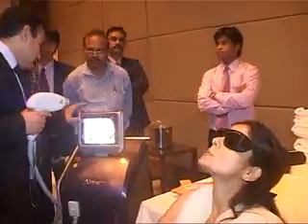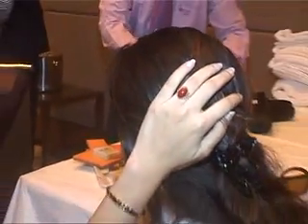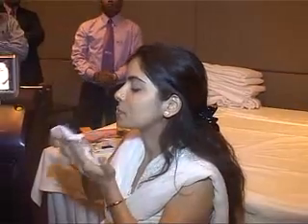So we have finished our 60 seconds. The upper lip treatment is over. We need to clean it. Precautions post the procedure are nothing major. There is not much peripheral edema — there could be mild edema, which is not seen in our case either. Putting makeup on after 12 hours is fine. Cold compresses are really not required.